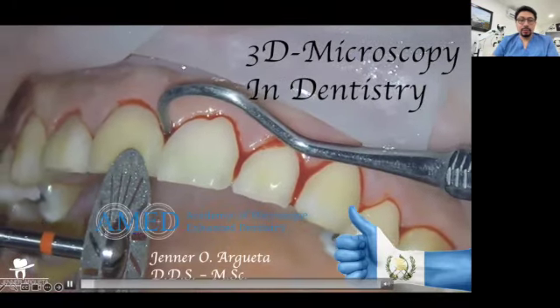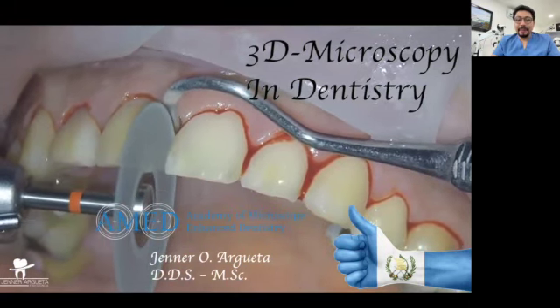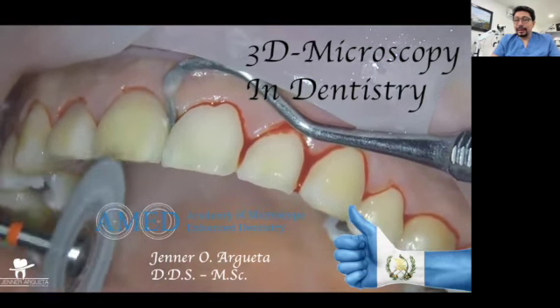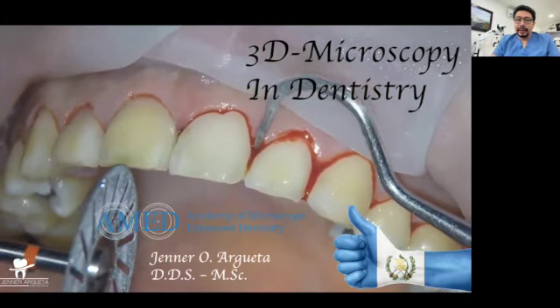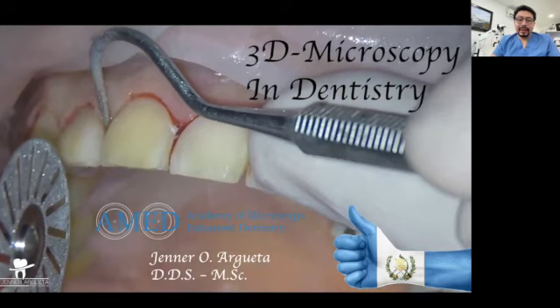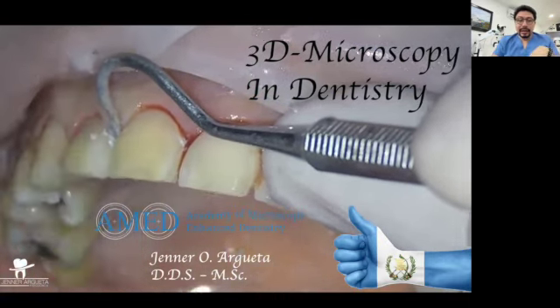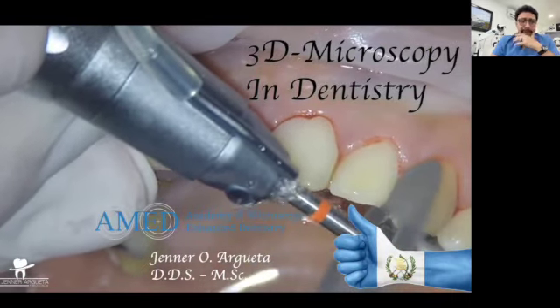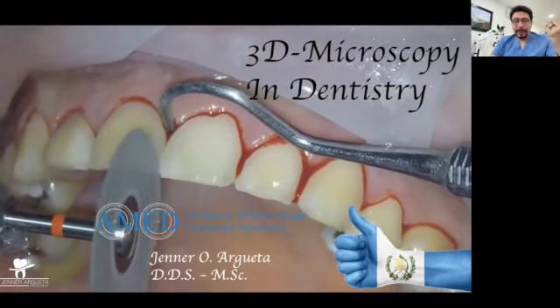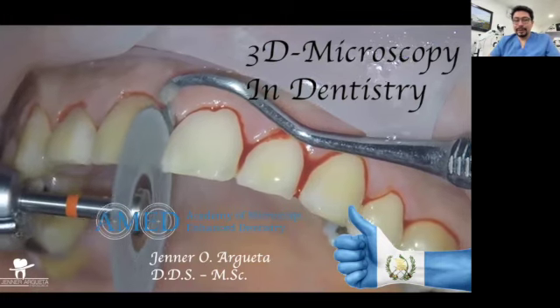The first thing that we need to understand is that microscopy is not only for endodontics. Microscopy can be applied in any area of dentistry, in restorative dentistry, prosthetic dentistry, in periodontics, and aesthetic dentistry as well, because we will obtain a better understanding of our operative field. We will have a better vision, we will have magnification, we will be able to have a more precise performance during our treatments. It's the first thing that we have been working on since a few years ago, trying to transmit this idea, because it is true that endodontics is the specialty in which the microscope was introduced in dentistry, because working inside of the root canal system is not easy.